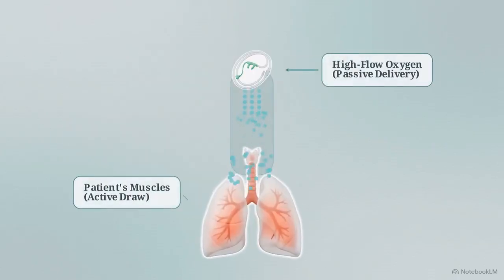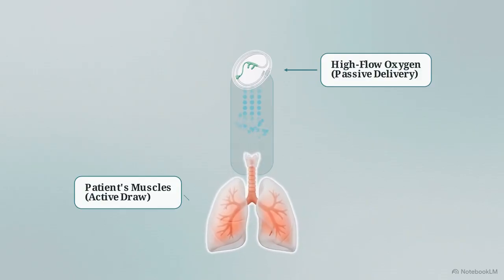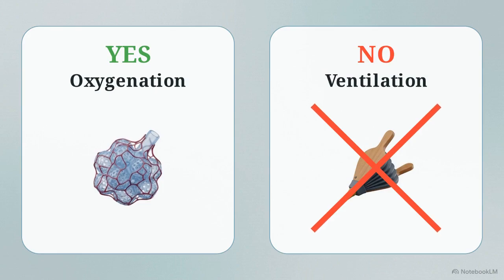But notice what the high flow doesn't do. It doesn't physically push bulk air into the lungs. It is an optimization tool for oxygenation, not a true ventilatory pump.